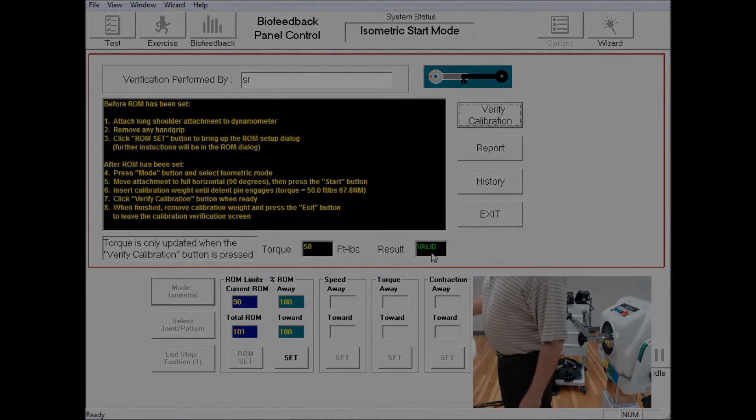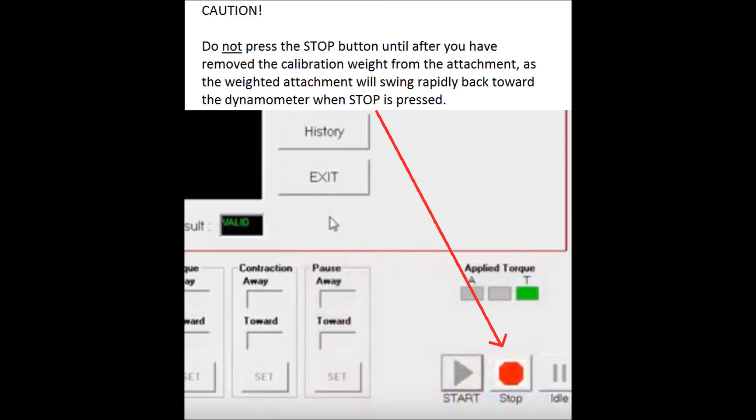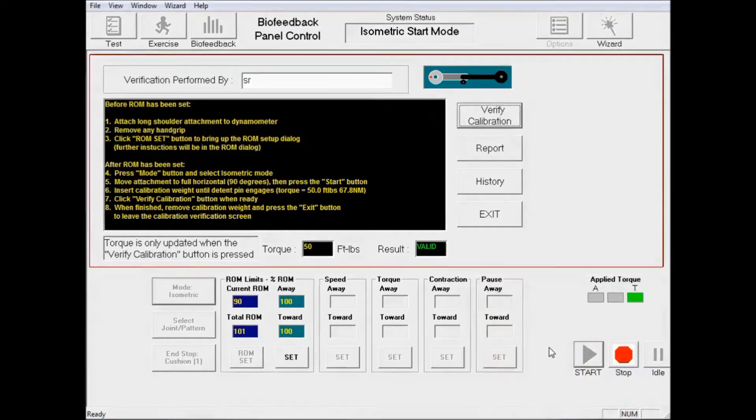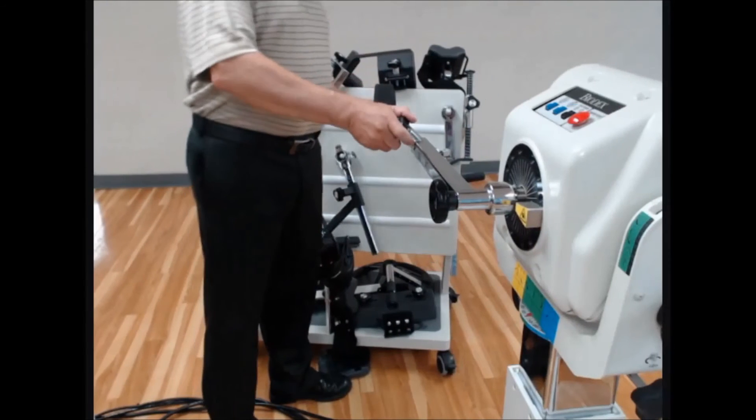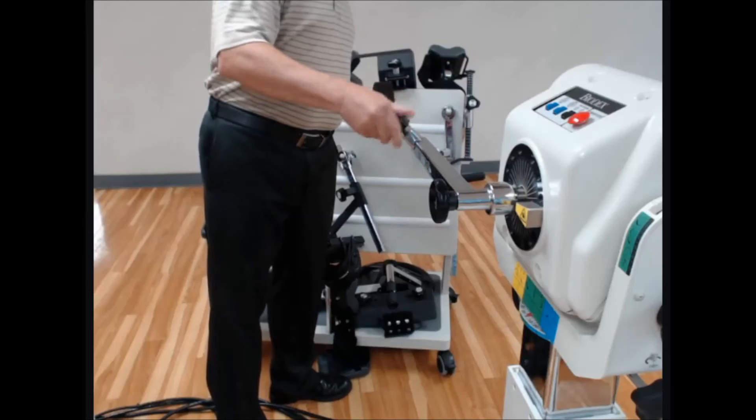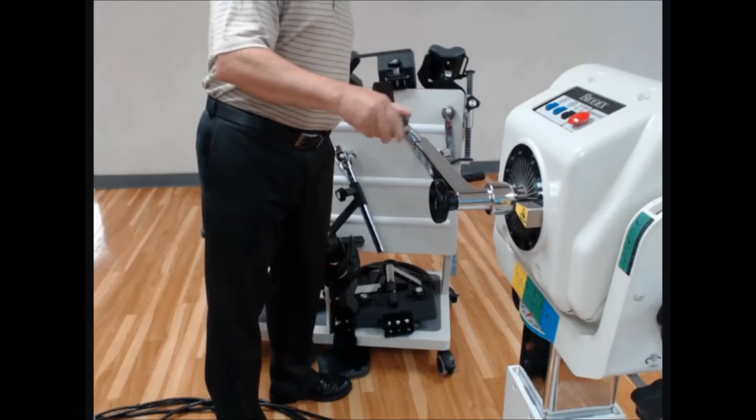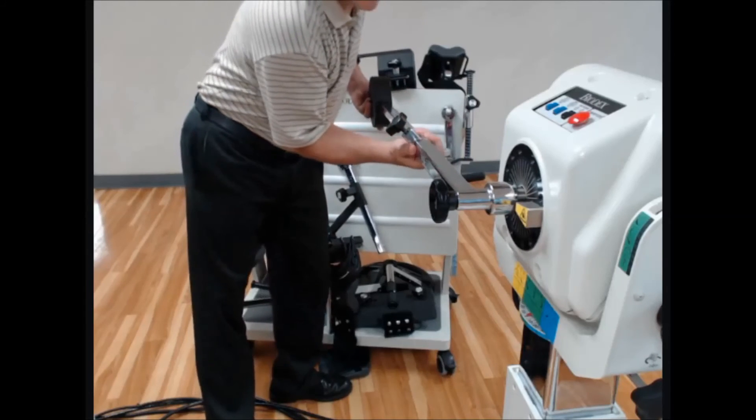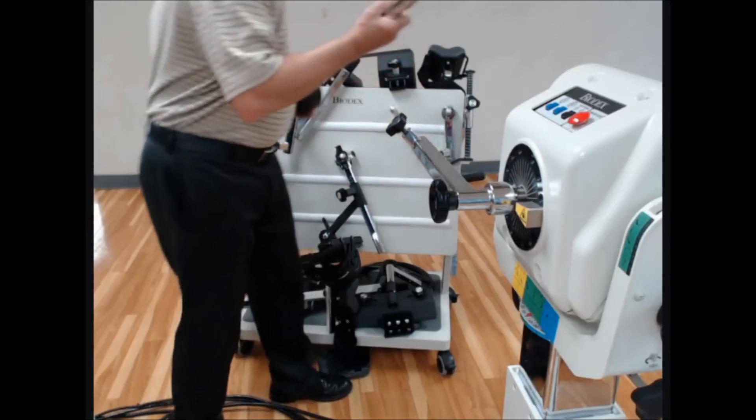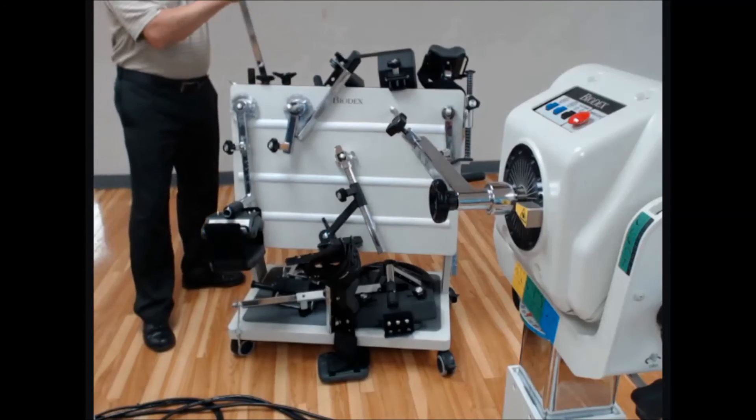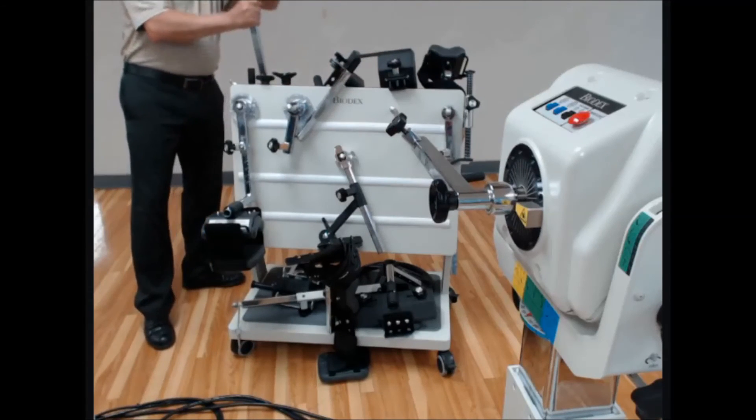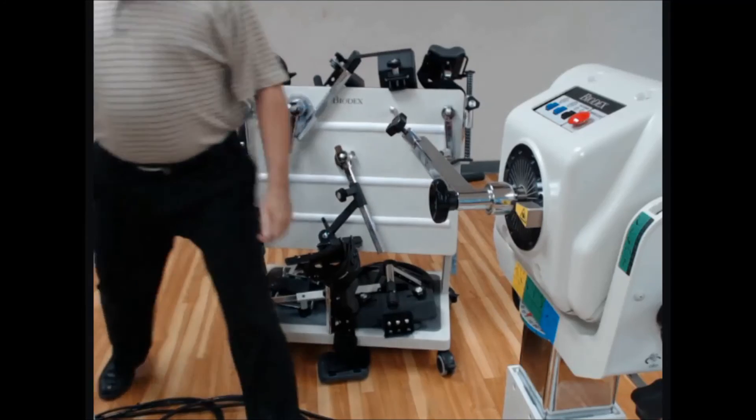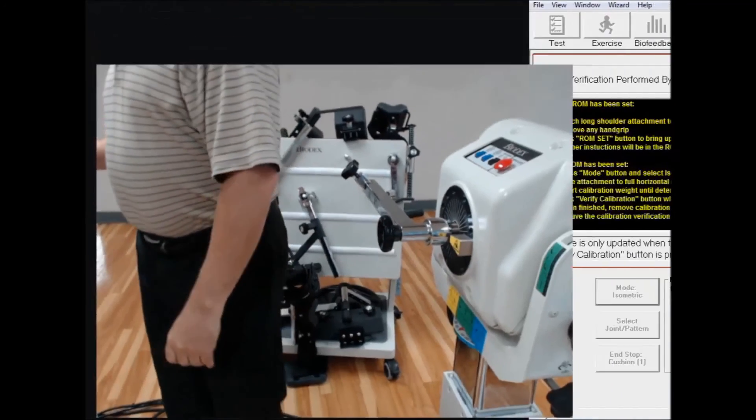Before clicking on Stop, because if we click on Stop the arm will drop, you want to remove the calibration weight for safety reasons. Place that back onto the card, then click on Stop.